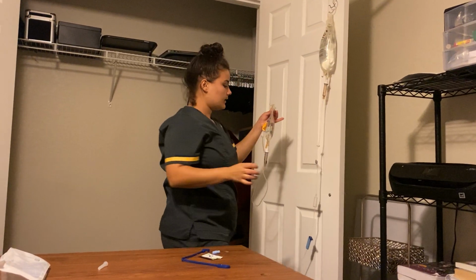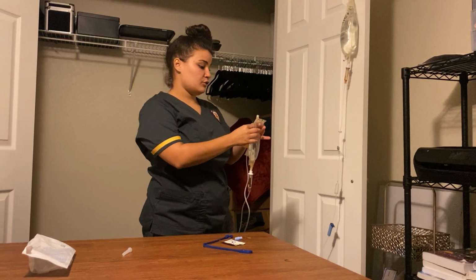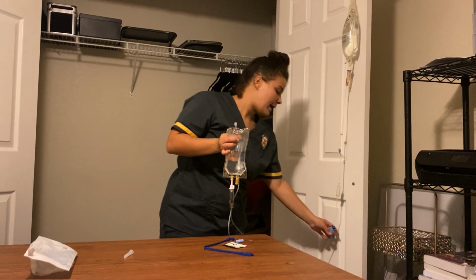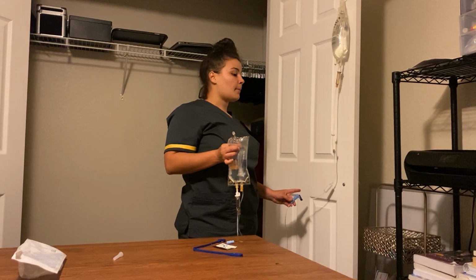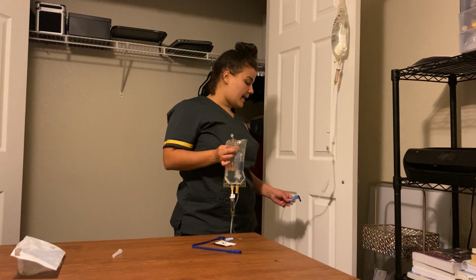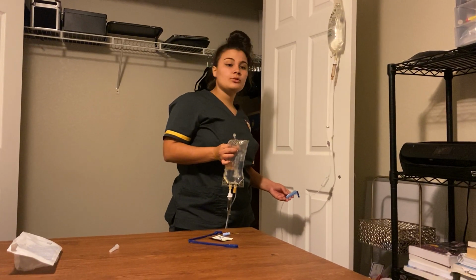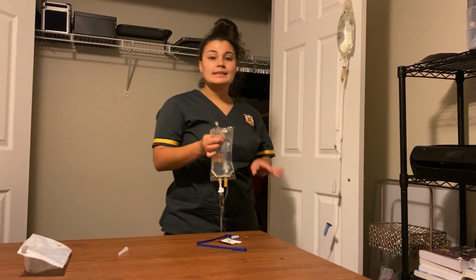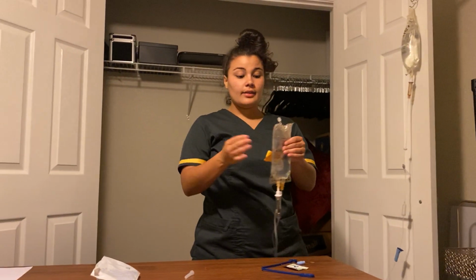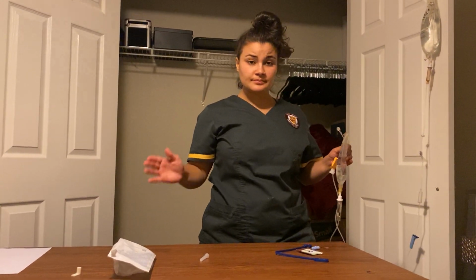All right. Now, whenever you do that and hang it up to the high position, you have to set the flow rate on your primary tubing back to what it was originally ordered. So after you set it back to what it normally was, you then discard your medication and everything else per facility policy.